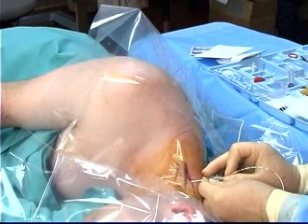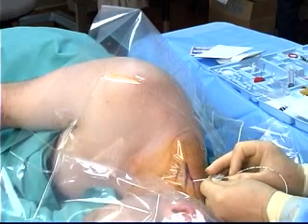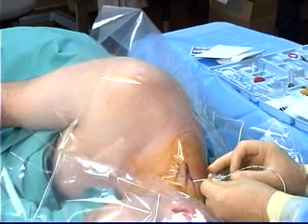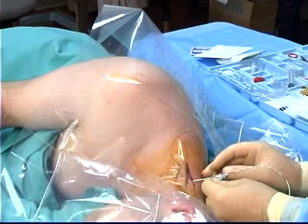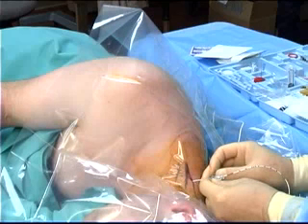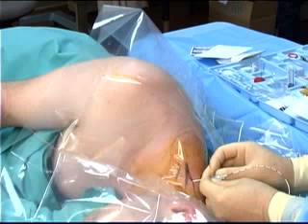The nerve stimulator is usually set at a current output of 1 milliamp or at an output that is comfortable for the patient. The motor response should be unchanged, and the broad black mark on the catheter indicates that the catheter tip is situated at the tip of the needle. It is important never to manipulate the needle if the broad black mark is not completely visible.